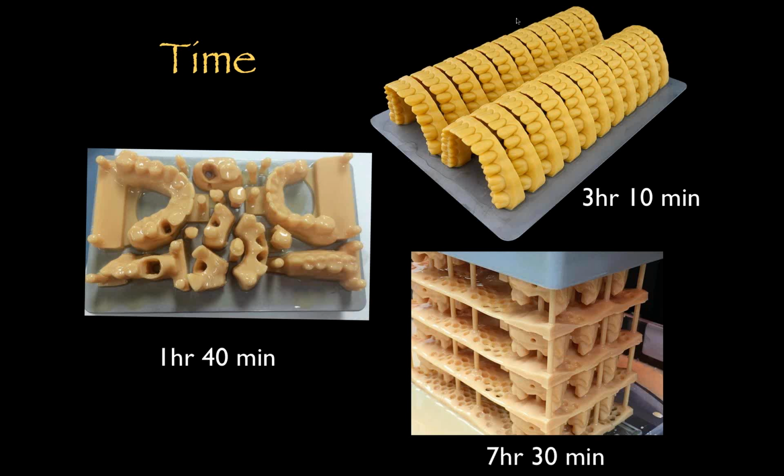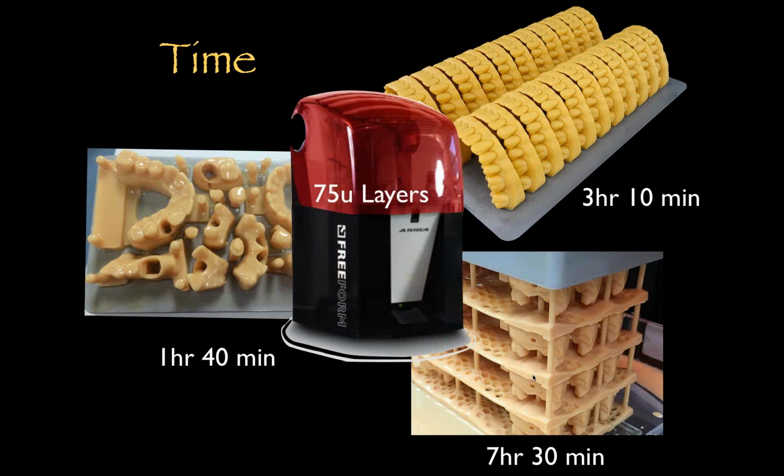So that gives you an idea: time is all about the z-axis and the vertical. If you don't have an extremely accurate z-axis transport, a mechanical transport in your printer, you're not going to be able to do this well. You'll have a lot of discrepancies and inaccuracies in the various layers. So if your plan is to get into high production, it's really worthwhile looking at a printer like this Asiga Pro.